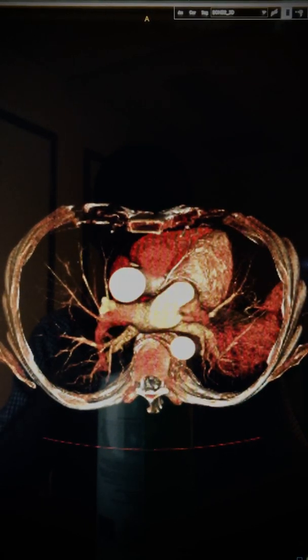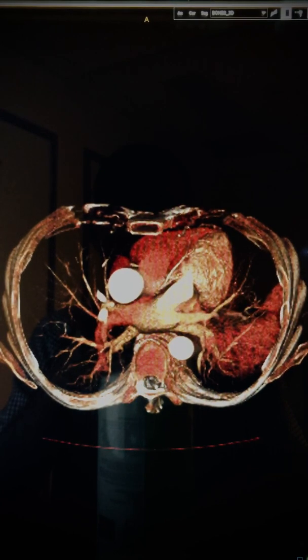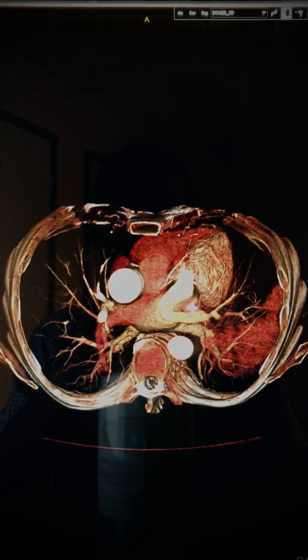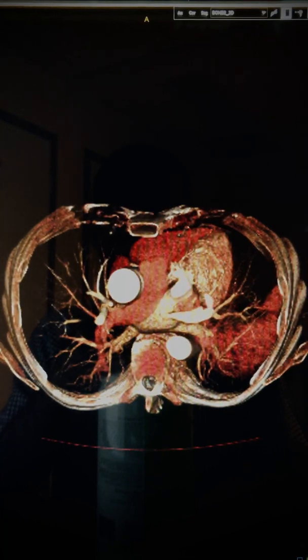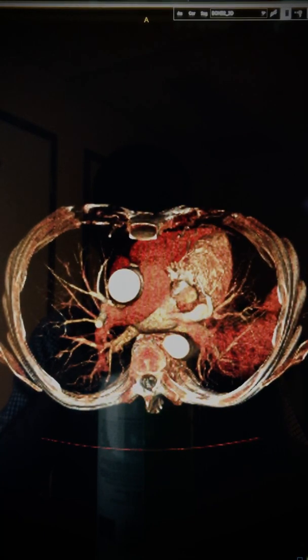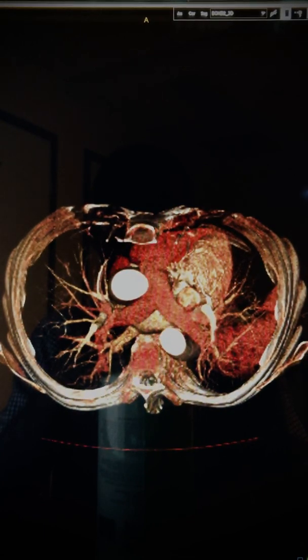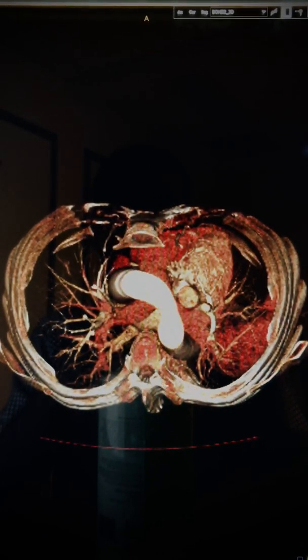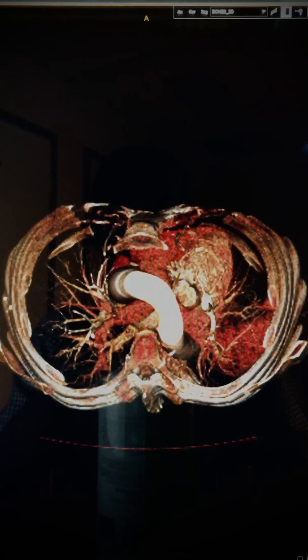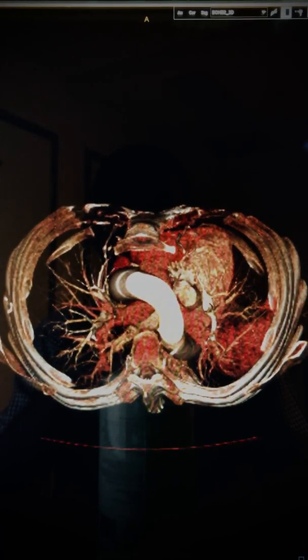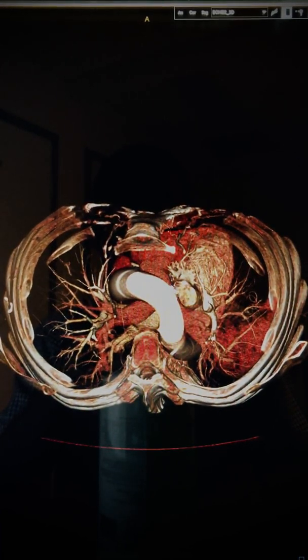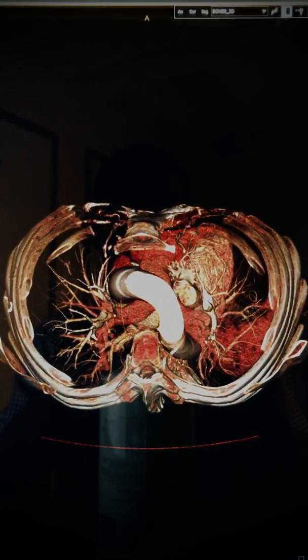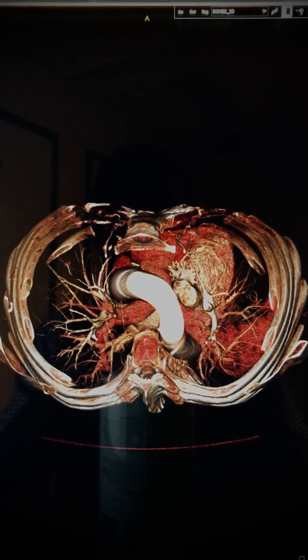It continues upwards into this location and further upwards. Here we are at the level of the aortic arch, where the ascending thoracic aorta is seen crossing through to the descending thoracic aorta.